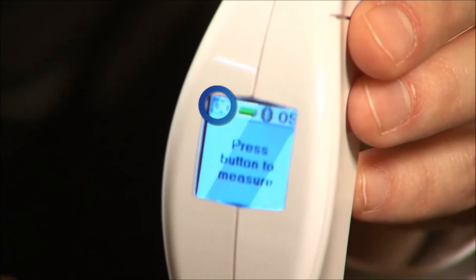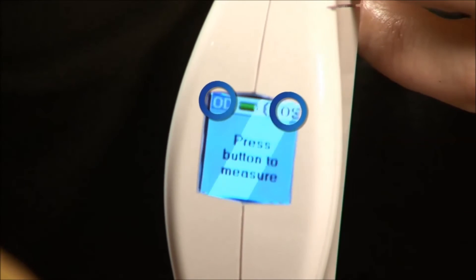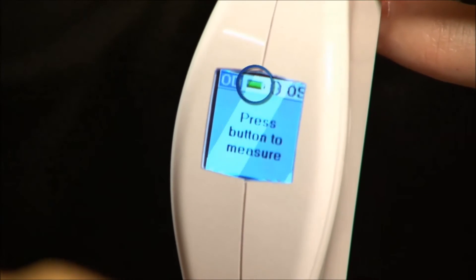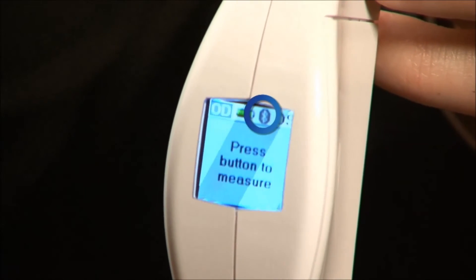You'll notice on the top that there's a position for an OD and OS — a right and a left eye measurement. You can switch back and forth easily between those two just by pressing the five-way control left or right. There's a battery status indicator on the screen, and there's also a very familiar icon that you see on your cell phone probably every day — that's a Bluetooth icon.